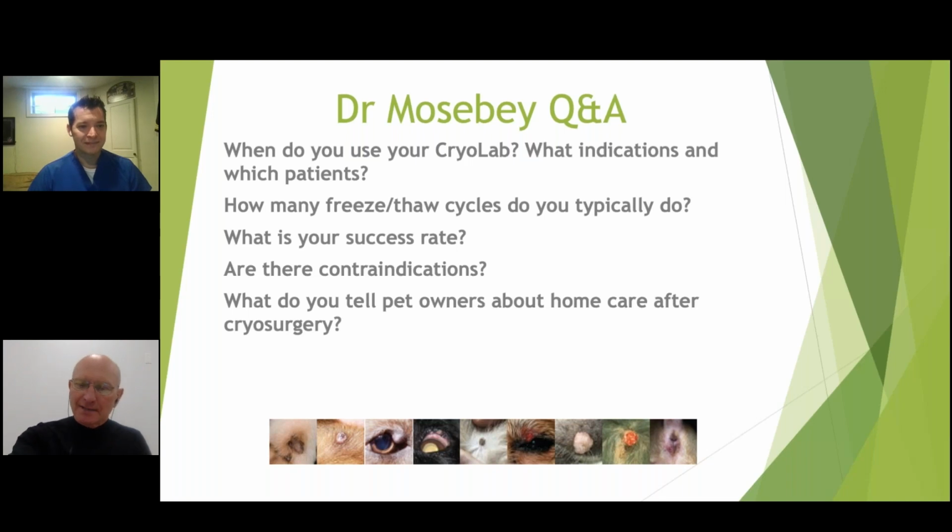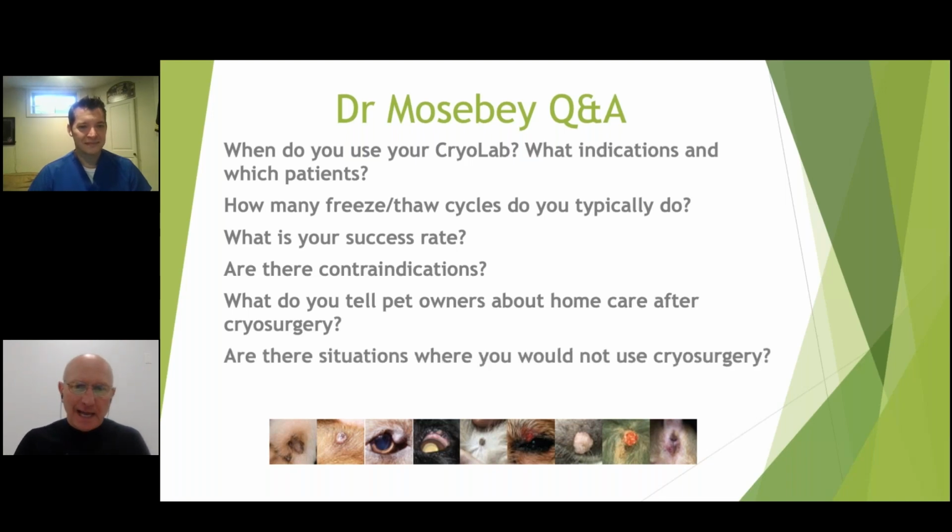Okay. All right. Last question, as we asked the clinician: are there any situations where you would not use cryosurgery? I guess anything that is certainly of a larger size, that I think might be quicker, easier to just go to surgery. Certainly we'll do that. Things where I'm suspicious maybe this isn't a totally benign lesion or something that's going to be recurrent, I might go to surgery before cryosurgery. And the mast cell tumor risk, those are probably the only 3 times.